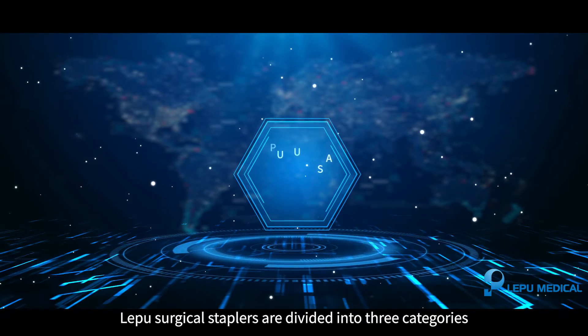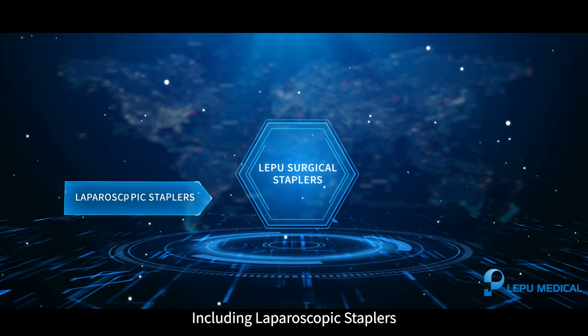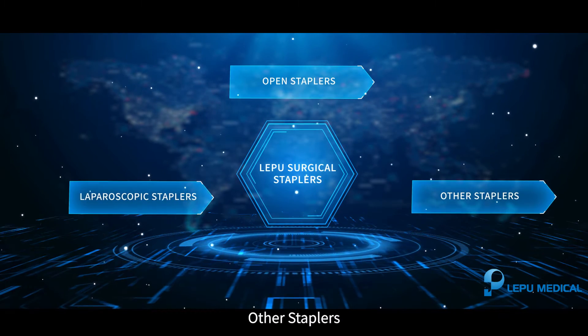Lepu surgical staplers are divided into three categories: laparoscopic staplers, open staplers, and other staplers.